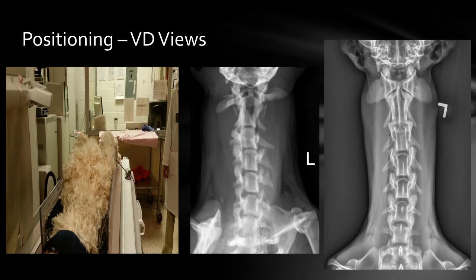This is very oblique. You see the scapula is completely asymmetric. You see the atlas is completely asymmetric. Each vertebra looks just really abnormal. This is a straight view. We see the spinous processes superimposed with the middle of the respective vertebra, teardrop shape, very straight, and perfect symmetry between the wings of the atlas and the transverse processes.